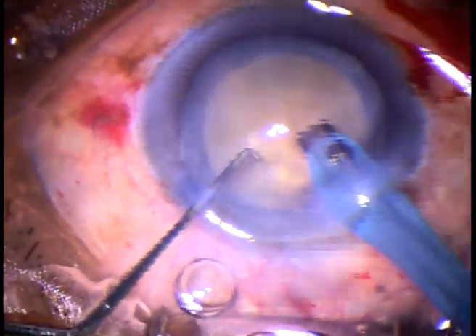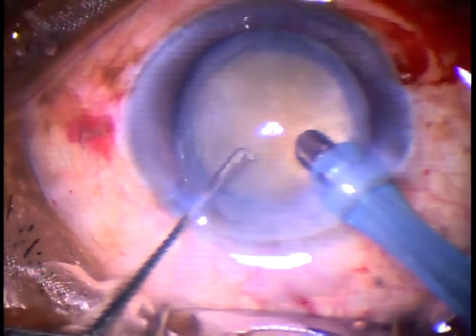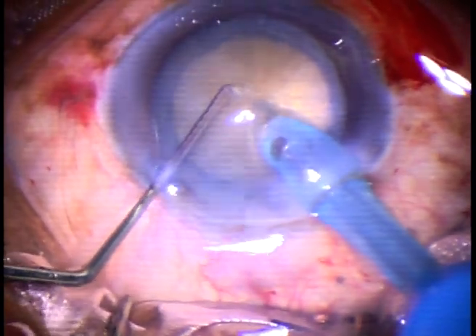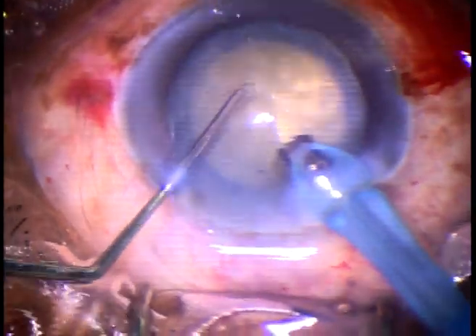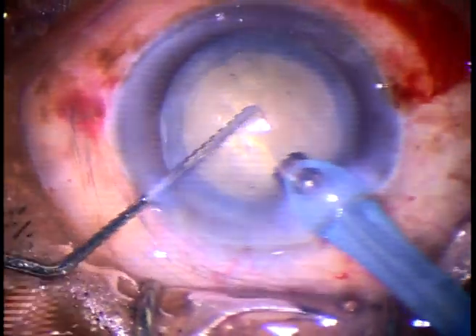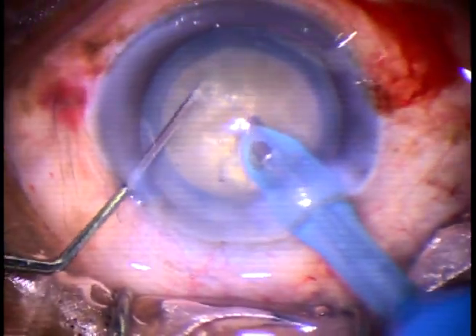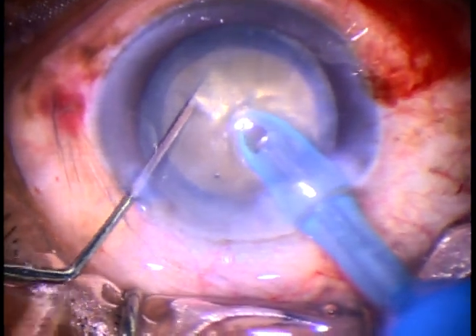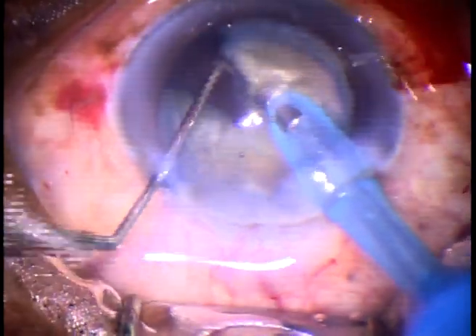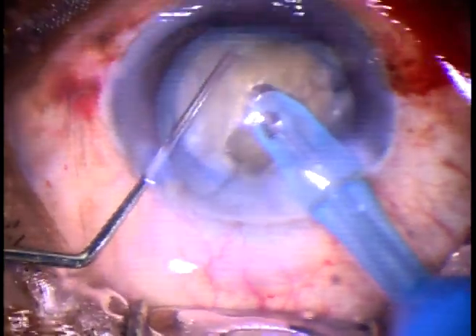If we make the bevel up and try to hold the nucleus, the nucleus will just go all around. So with bevel down, I am making a tunnel to some distance. Now I make the bevel up, and go through this tunnel into the substance of the nucleus. And now I can hold this nucleus very nicely. So in case of free-floating nucleus, make a tunnel with bevel down, then make the bevel up, go through that tunnel with bevel up, hold the nucleus and chop it.